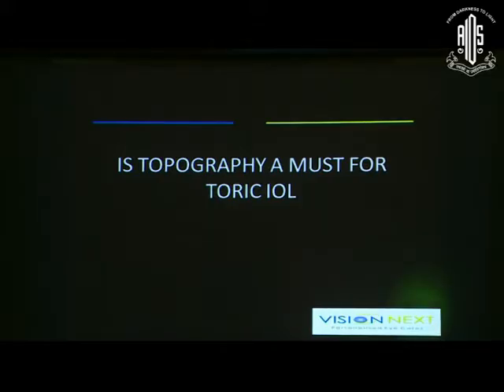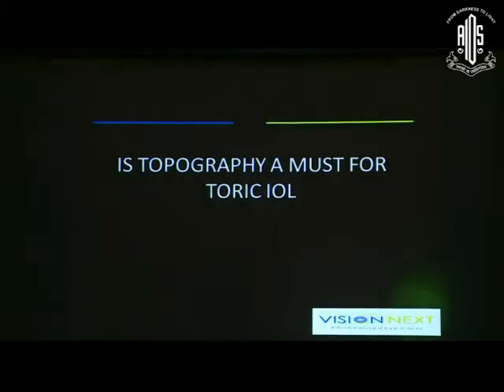Well, there are established studies which clearly say that auto K values or manual keratometry values have not been up to the mark in correcting the astigmatism with toric IOL. So we need something more. Now in the market there are optical biometers available and topography available. So we'll discuss why topography is important in all toric IOLs.